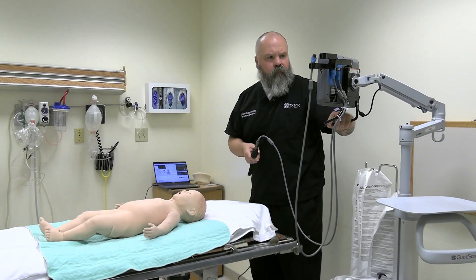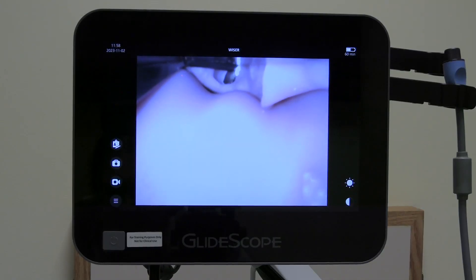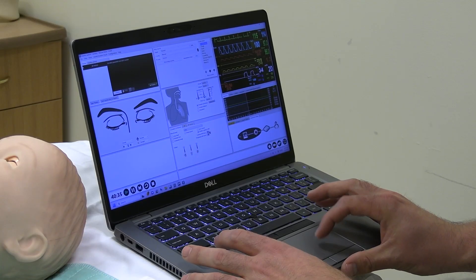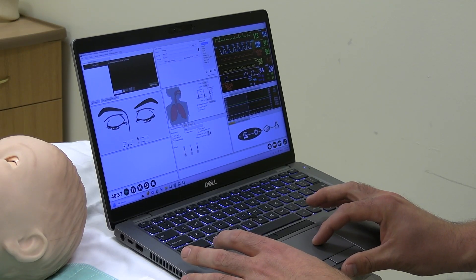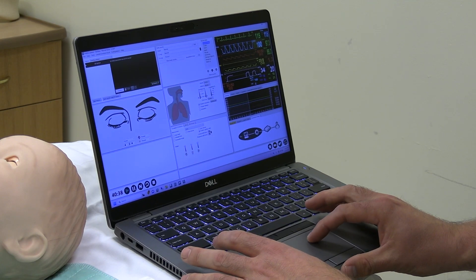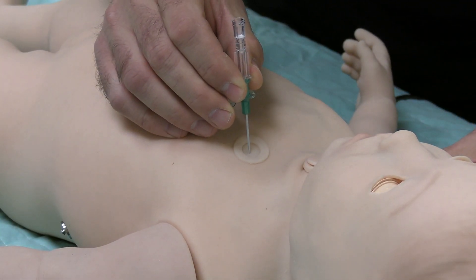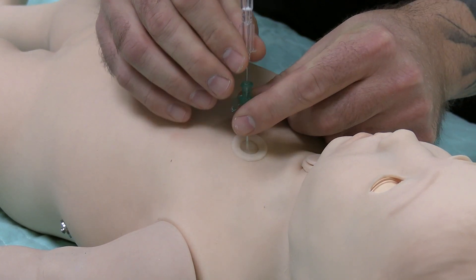SimBaby has many airway features helping simulate different difficult airway scenarios. Airway features include tongue swelling, pharyngeal obstruction, and laryngospasm. You can also simulate a foreign object in the airway. Airway resistance and lung compliance can both be simulated and controlled in the software. Simulating a pneumothorax can also be set up and treated with real needle decompression.